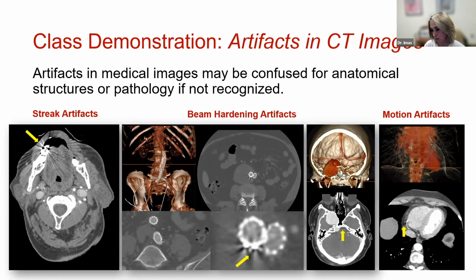If you are looking at this image, this really happens around the bone, dense tissue. This is also an area where strokes are fairly common, especially with an aneurysm. If there's bleeding, it's likely that there could be some ischemia in the brain. If you are not familiar with beam hardening artifacts, this area could be misdiagnosed as a potential infarct or ischemic region in the brain, whereas in reality, it's a pretty standard location for this beam hardening artifact because you're in the vicinity of the bone.